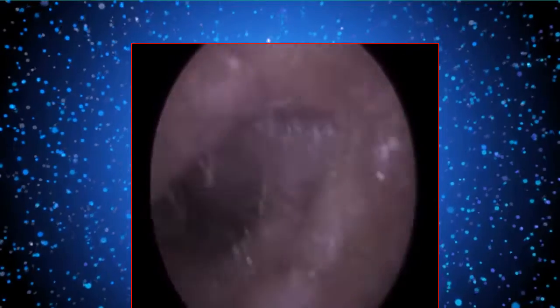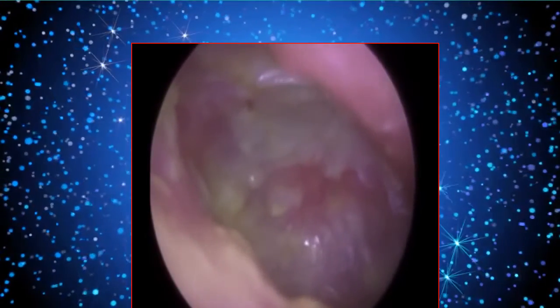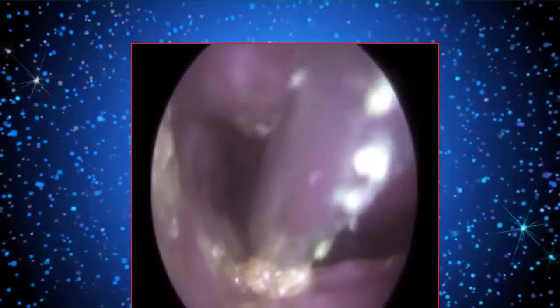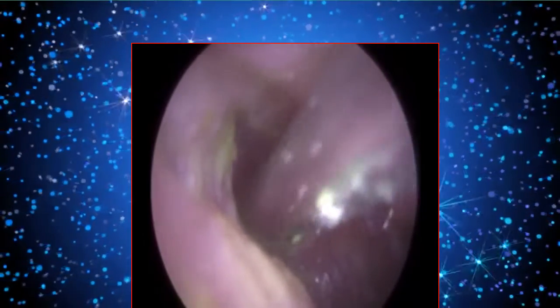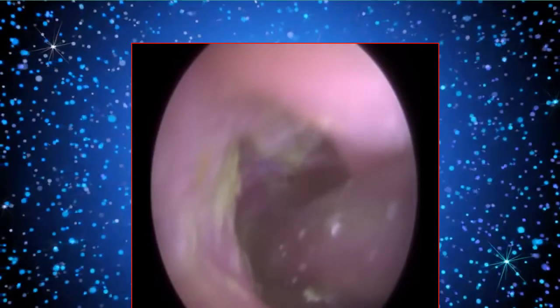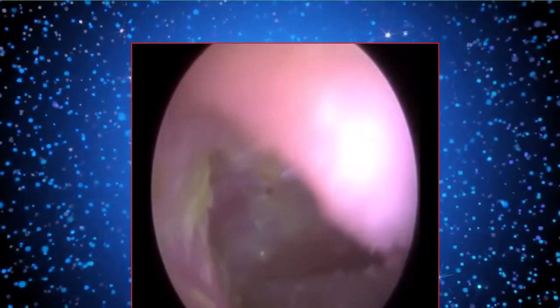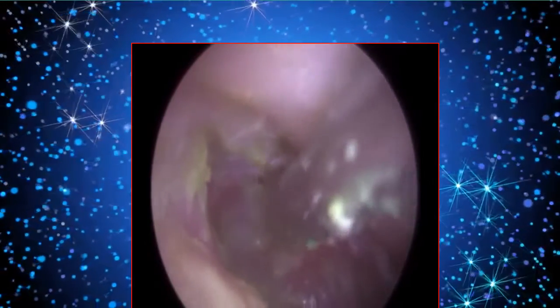So I've given him some treatment. It was impossible to diagnose that before for myself or the ENT because you just couldn't visualise the eardrum, but I did a pressure test and we were able to diagnose that, so I've given some treatment for that. So I'm just mopping up now. We did so much, I just wanted to get as much debris and infection out of the ear to stop it from coming back really, despite the patient having 10 days extra repeat prescription.